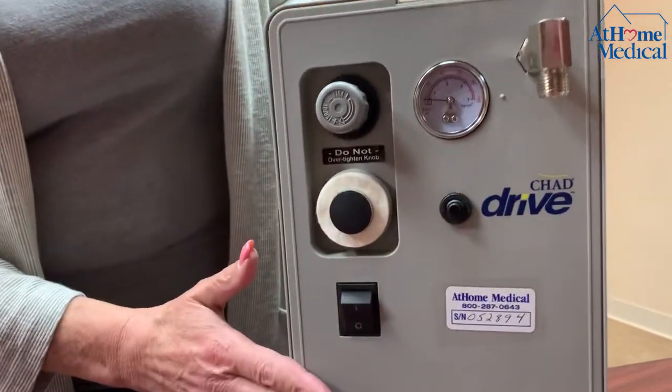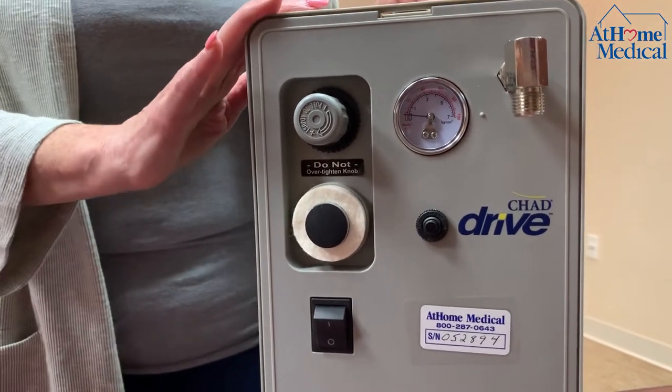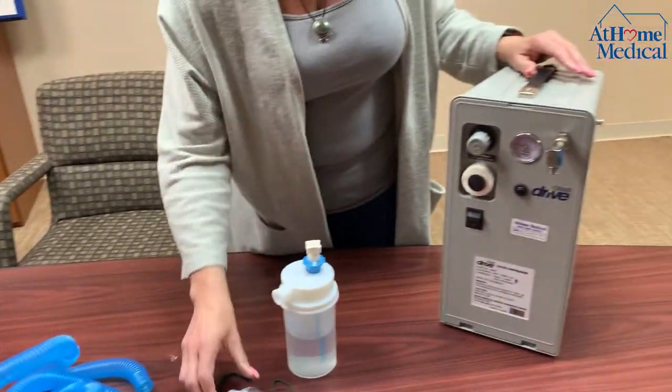This is your circuit breaker for the machine itself. The reason we're using this is for patients coming home with a trach who need aerosolized moisture. We're giving you hydration through the airway.